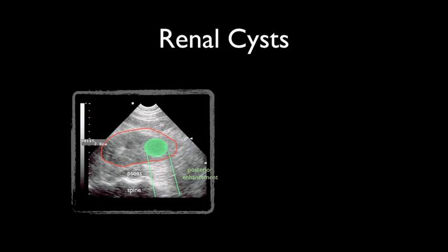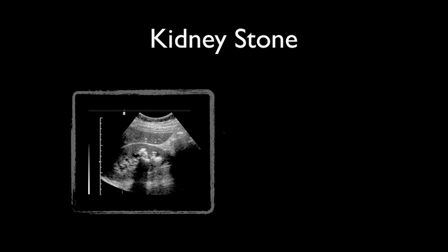Renal cysts can sometimes be mistaken for hydronephrosis. Cysts are typically single and arise in the periphery of the kidney, but can be multiple, as in polycystic kidney disease. Here's an example of kidney stones with acoustic shadowing.